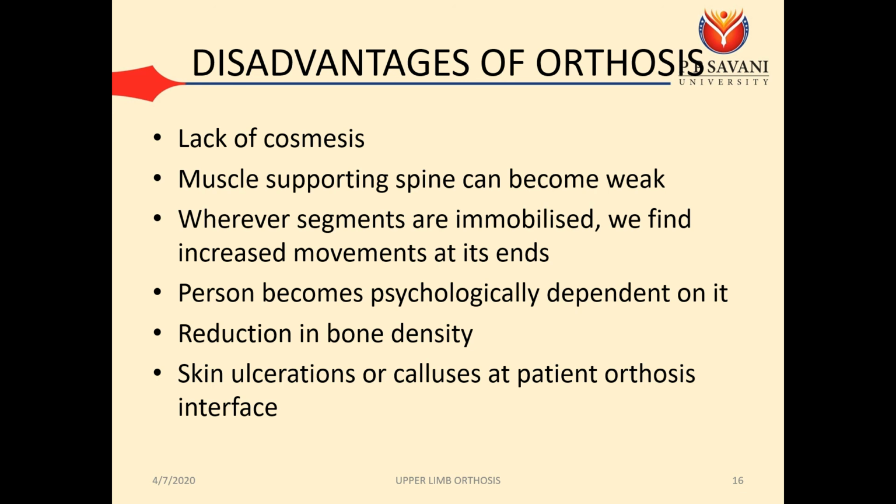Fourth, the person becomes psychologically dependent on it. Patients often think that orthosis is the only key. They can walk, they can do activities, and hence they become dependent on it chronically with time.